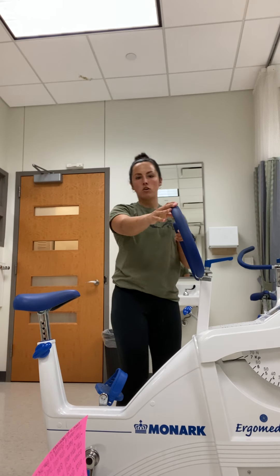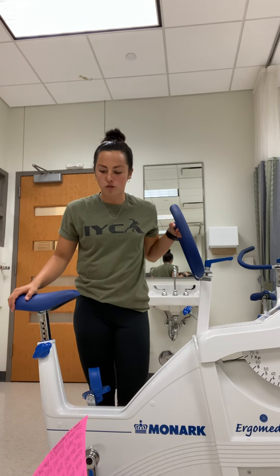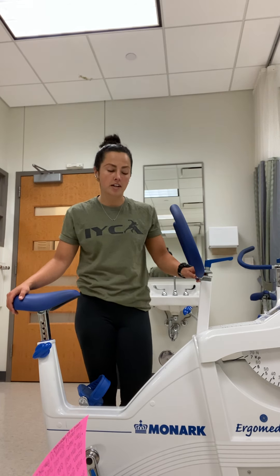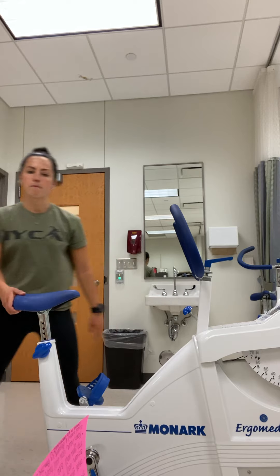The biggest thing though is to make sure the client is comfortable. So if they hop on and they're really uncomfortable, throw those guidelines out the window and just adjust accordingly so that they're comfortable for exercise.